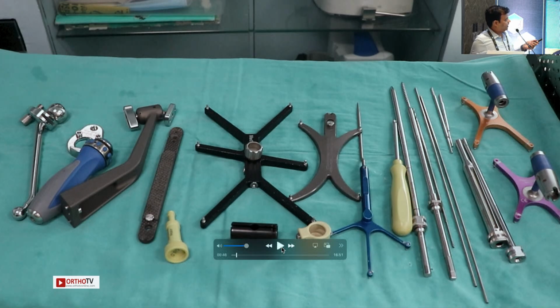Ultimately, these are the instruments mainly which you use. This is the navigation reference array, and this is the Schanz pin bridge, which allows us to marry the patient to the robot. And these are the connectors basically to have your O-arm spin and have the patient registered to the navigation. And these are navigation trackers and guide wires and tap and all that. And the tap has a fixed length of 30 millimeters. It just crosses the pedicle, enters the posterior vertebral body, and stops there.